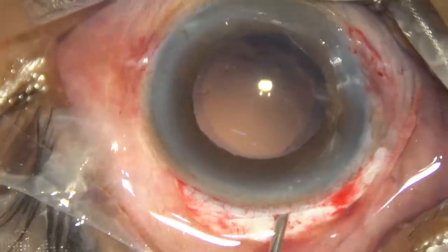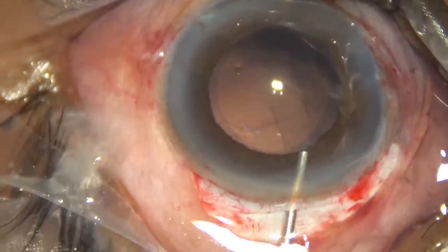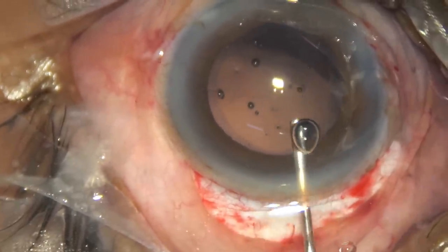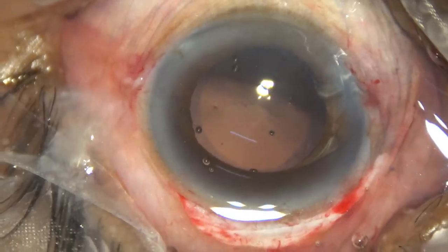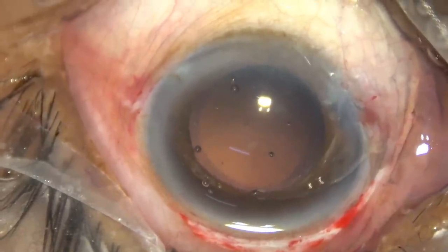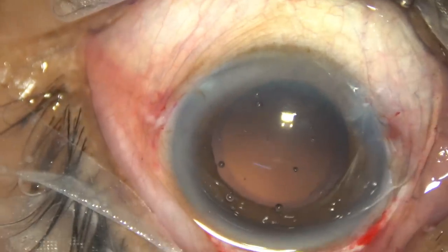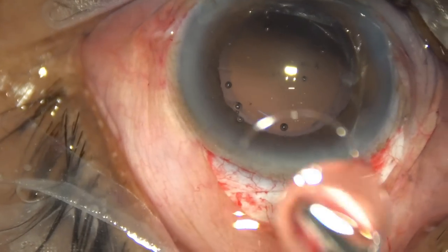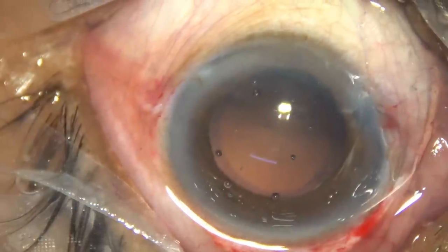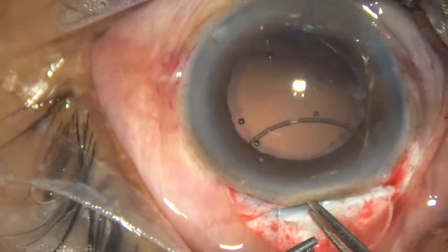I'm now going to implant the lens. Before that, this is filling of the anterior chamber and bag with the visco. Since we have a large optic, I'm going to place this lens. This is a Liberty lens from Appasamy Associates. Goes here. Hold it with another forceps.